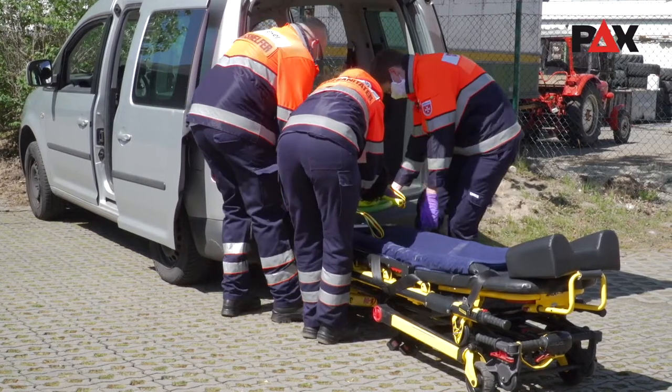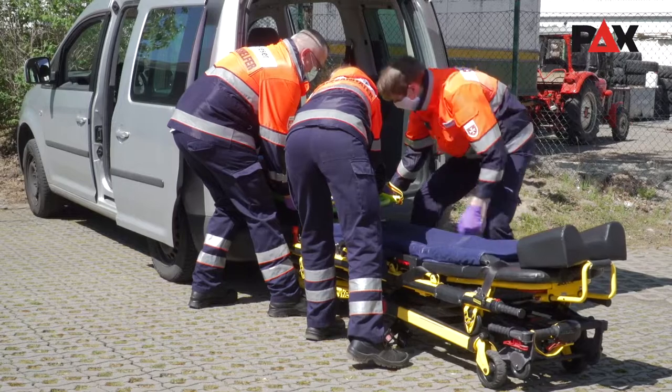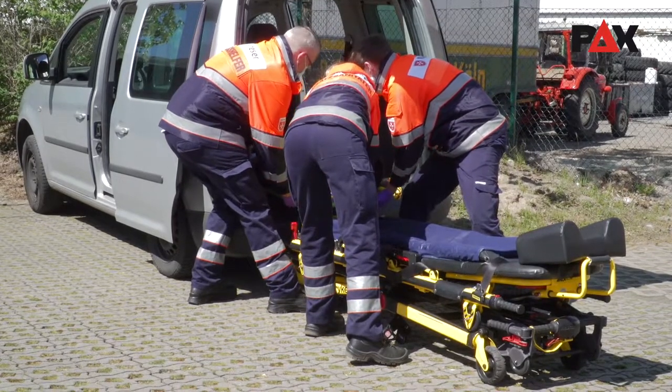The patient is then placed on the stretcher in the final position. The tension on the BOA must be maintained until manual fixation of the head is secured.